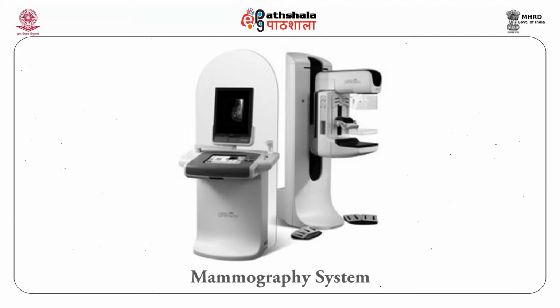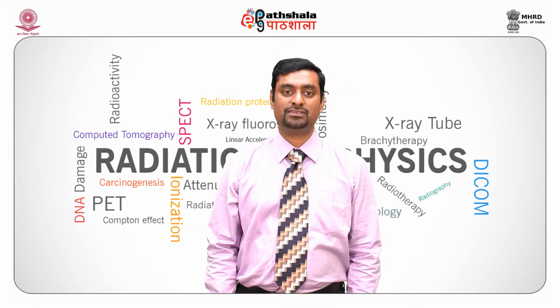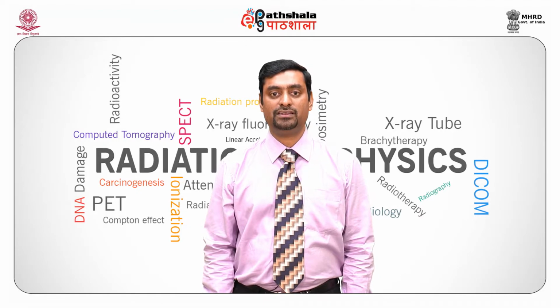What does mammography mean? Mammography is a study that uses low energy X-rays for imaging the breast for diagnosis and screening.